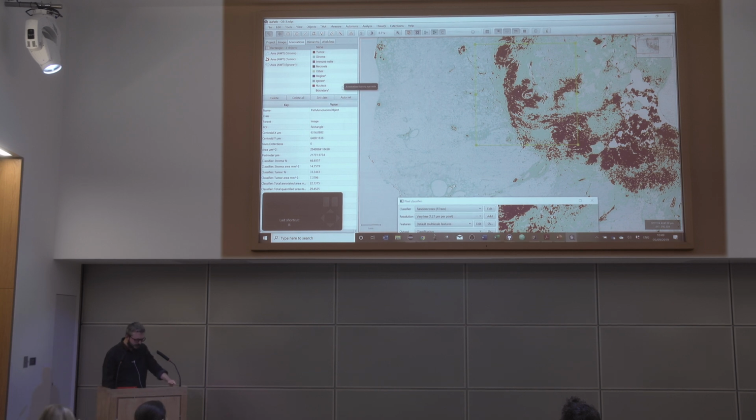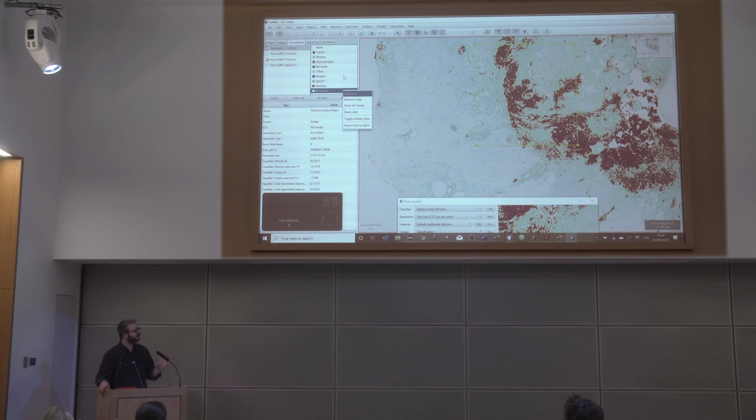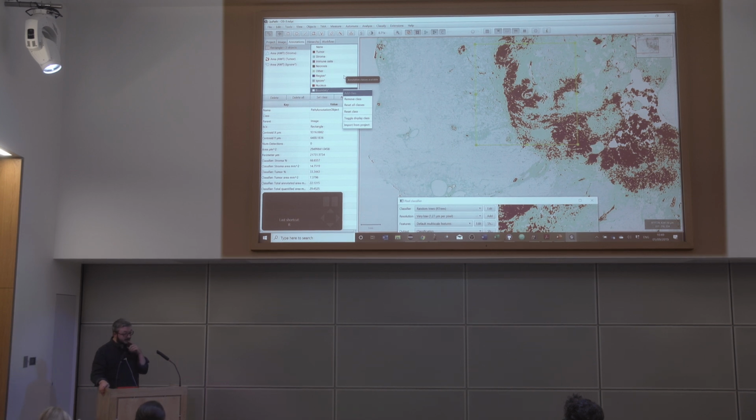Yeah, you can. So you can add whatever classes you want in here. There is no built-in limit to the number of classes, except, well, as of the last few days, there might be, but it's maybe 255 if it stores in an 8-bit image, so thereabouts. I suspect the issue is going to be calculating the features that enable you to distinguish those classes. But yeah, there are other alternatives to that as well.